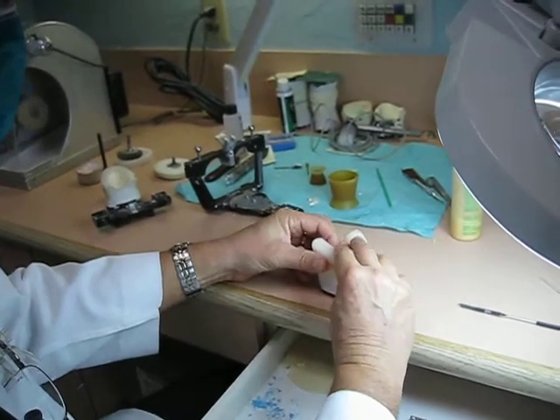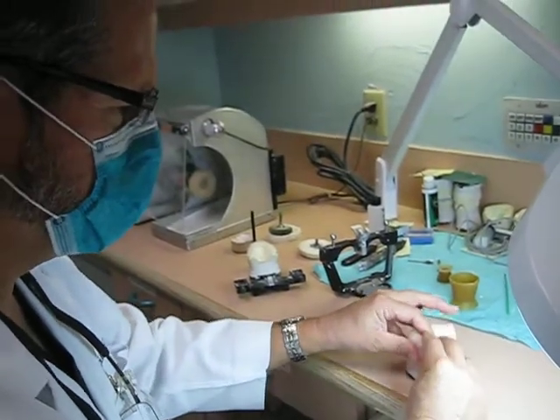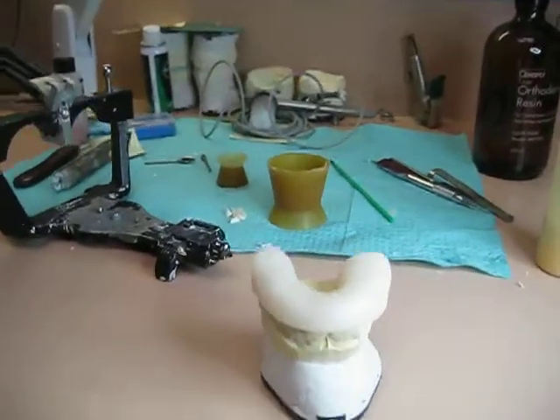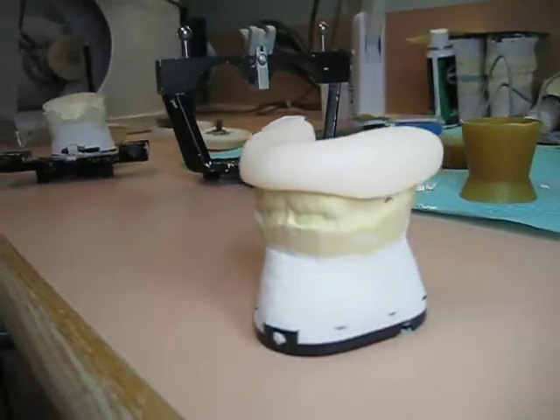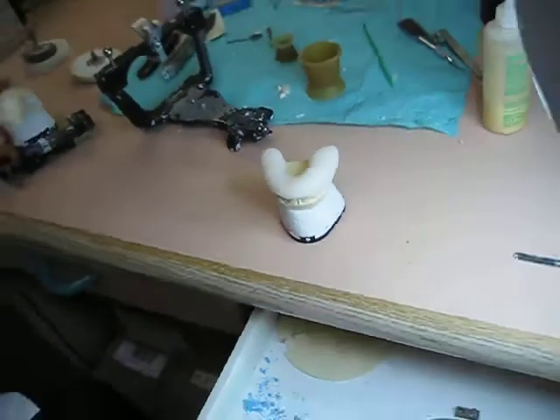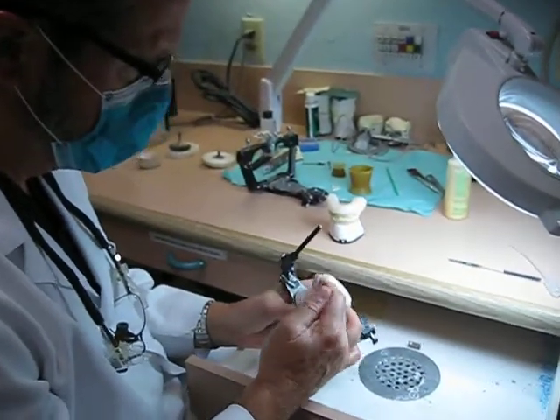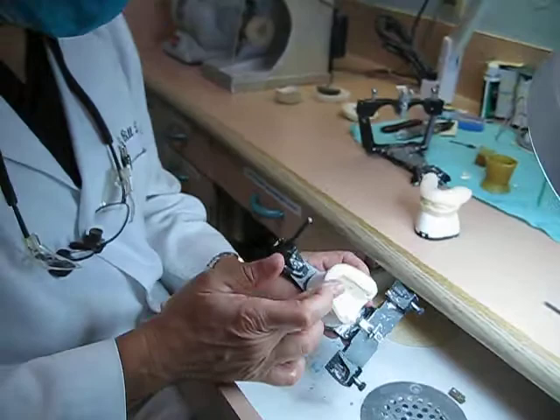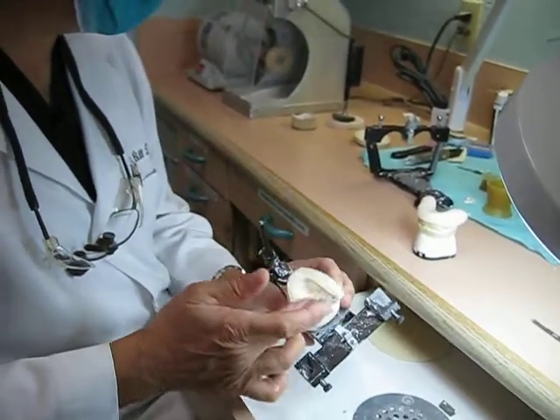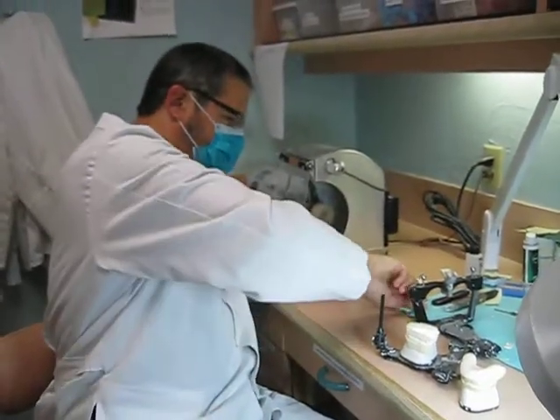That we want to finish it to. I'm going to let it stay there for a second, and you can pan in on that if you want to. And this is a dual appliance technique, so I've already made the appliance for the upper jaw, and I'm going to lubricate it with just some petroleum jelly. And I've got a little bit too much, as is the case much of the time.